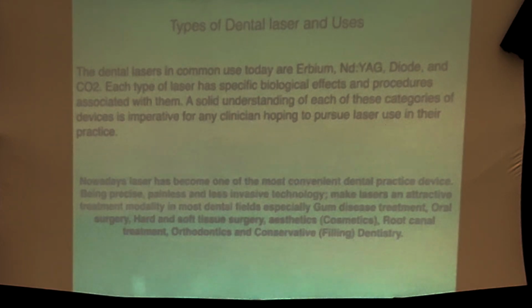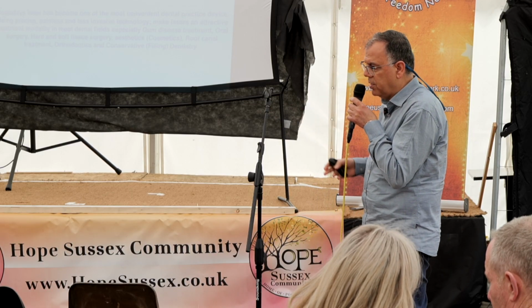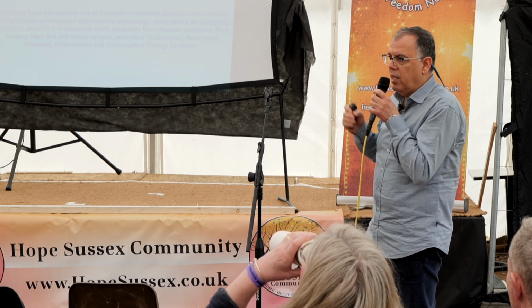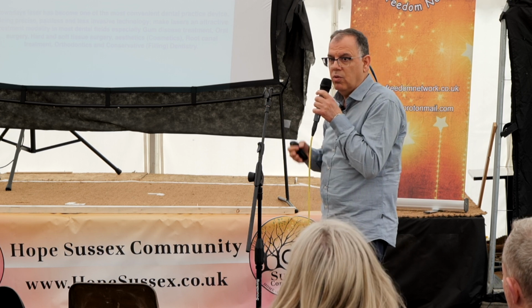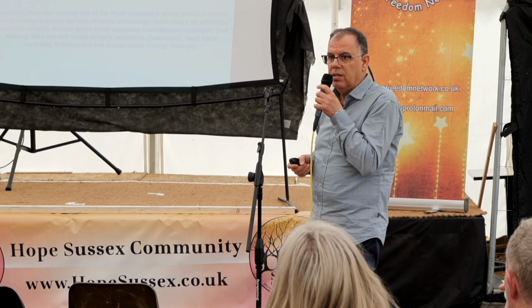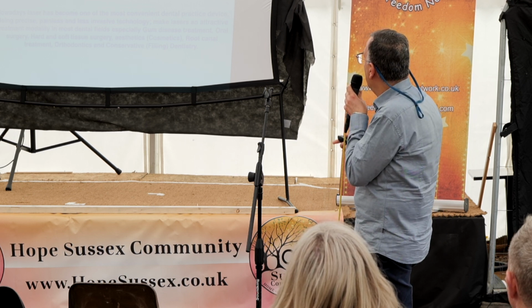So there are erbium, Nd:YAG, and diode lasers. Most of the lasers being used are diode lasers and erbium lasers. The erbium laser is mainly a hard tissue laser for the teeth, for cavities, for desensitization, for bone and jaw operations, and for sterilizing the bone after extractions of infected teeth. The diode laser can be used for gum disease treatment, for gingivoplasty, and for many other jobs regarding the soft tissue, the gingiva, gum, and the oral mucosa.